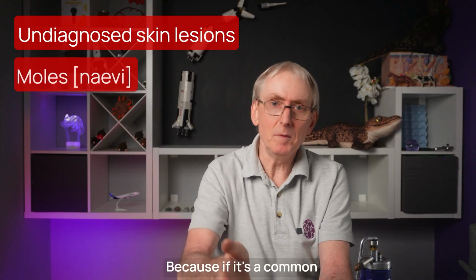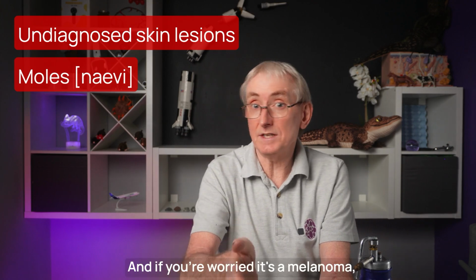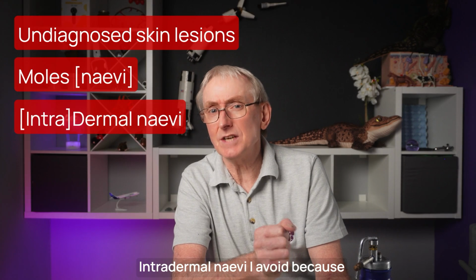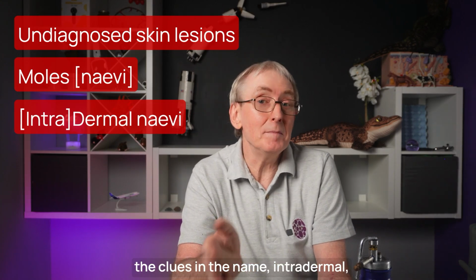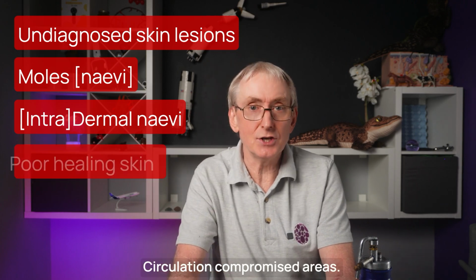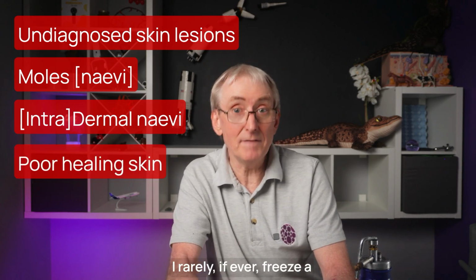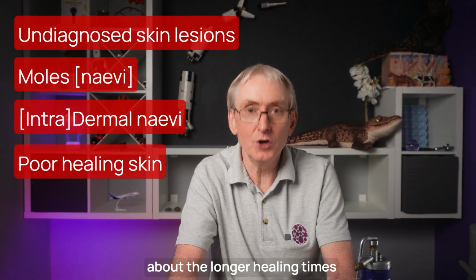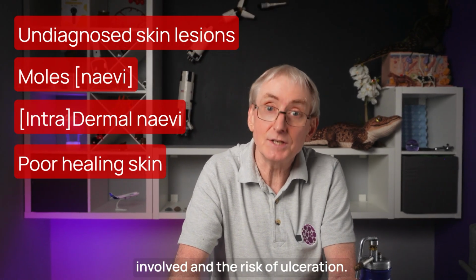Moles, because if it's a common mole, why are you treating it? And if you're worried it's a melanoma, it needs cutting out, not cryotherapy. Intradermal nevuses I avoid because the clue's in the name, intradermal, and they have deep roots. You leave some behind. Circulation compromised areas. I rarely, if ever, freeze a lesion on the lower leg. It's possible, but I warn the patient about the longer healing times involved and the risk of ulceration.